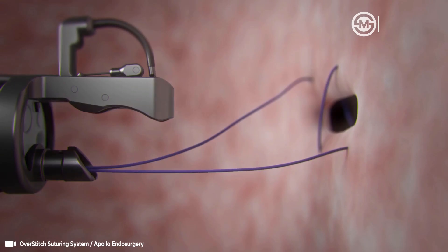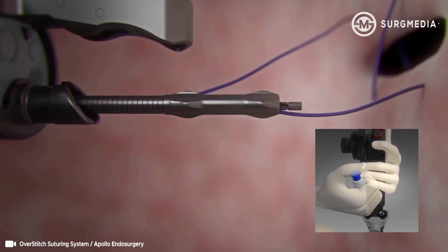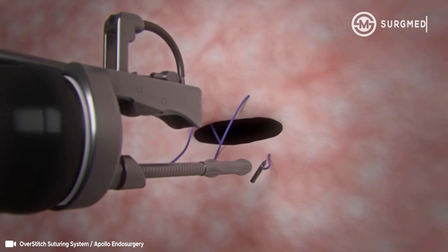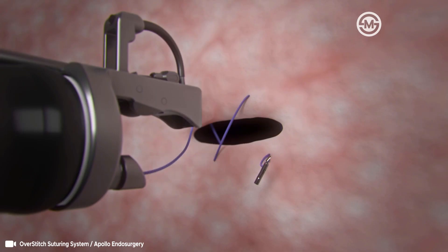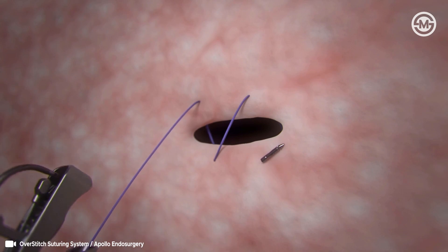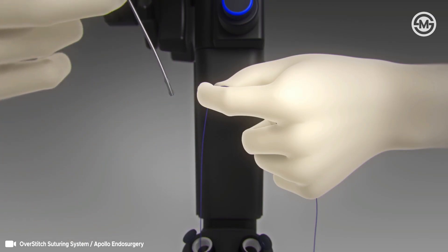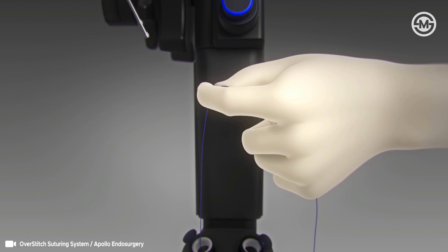To prepare for cinching, extend the anchor exchange catheter approximately three centimeters past the end cap. Press the blue button and pull back on the anchor exchange to release the anchor. Remove the anchor exchange catheter from the 3.7 millimeter scope channel, leaving the suture in place.